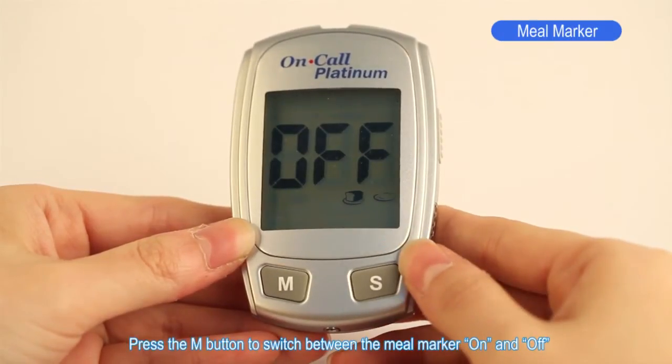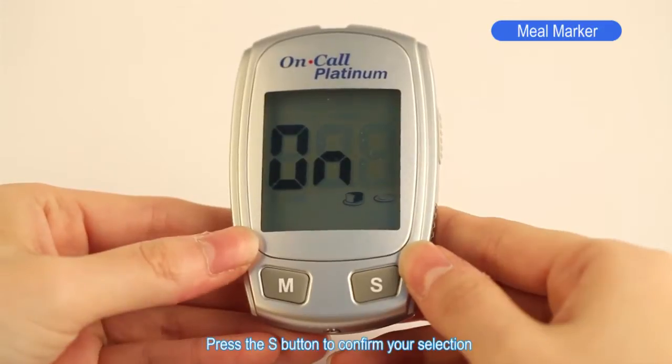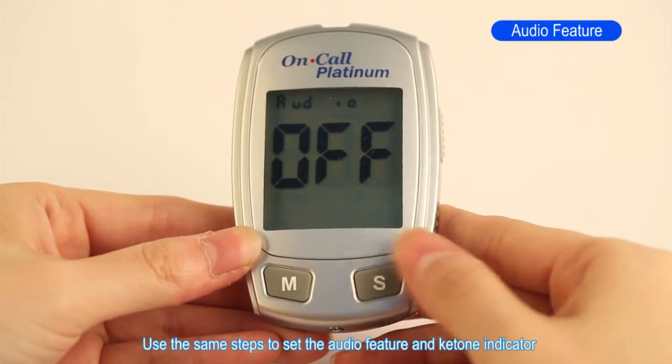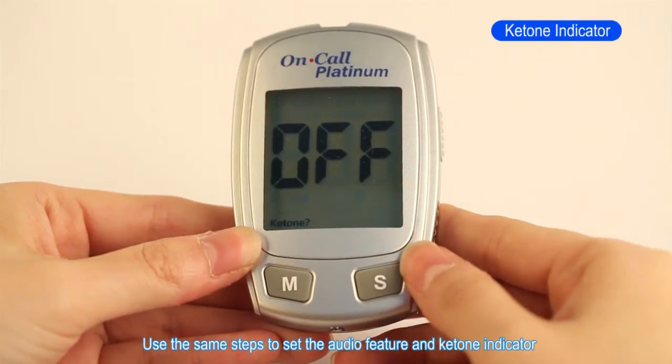Press the M button to switch between the meal marker on and off. Press the S button to confirm your selection. Use the same steps to set the audio feature and ketone indicator.